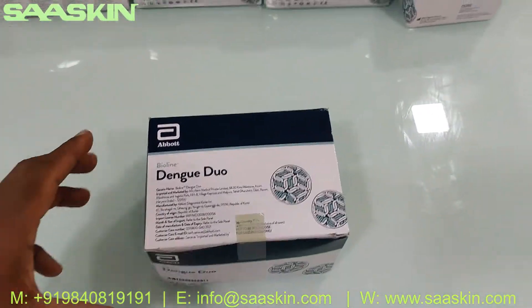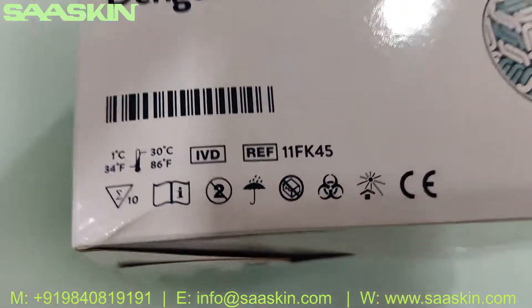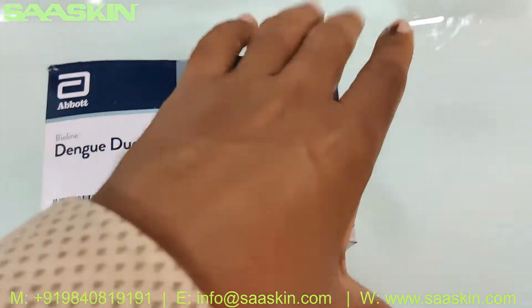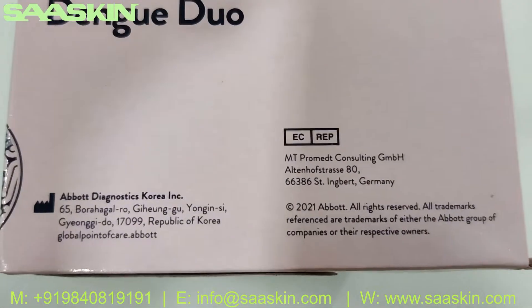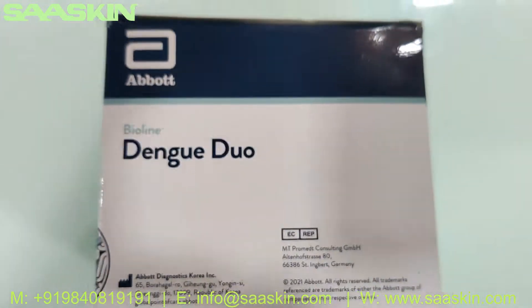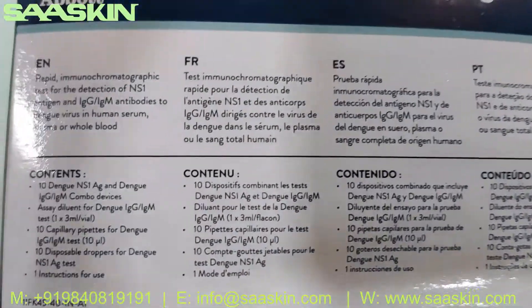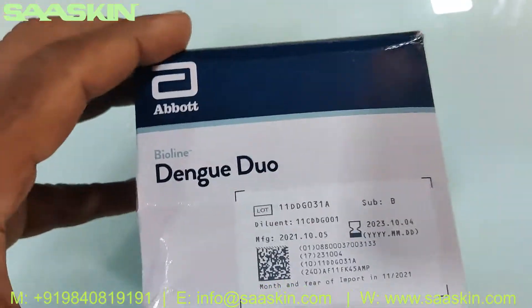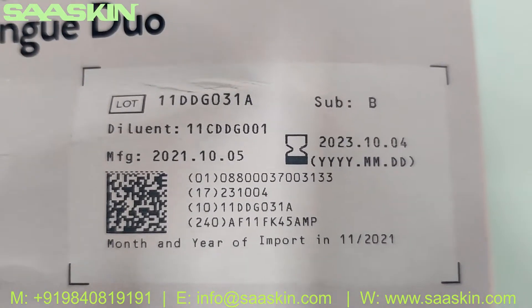This is a completely CIUDD certified product and this is the part number. It is manufactured in Korea, and it has a standard two-year expiry period.